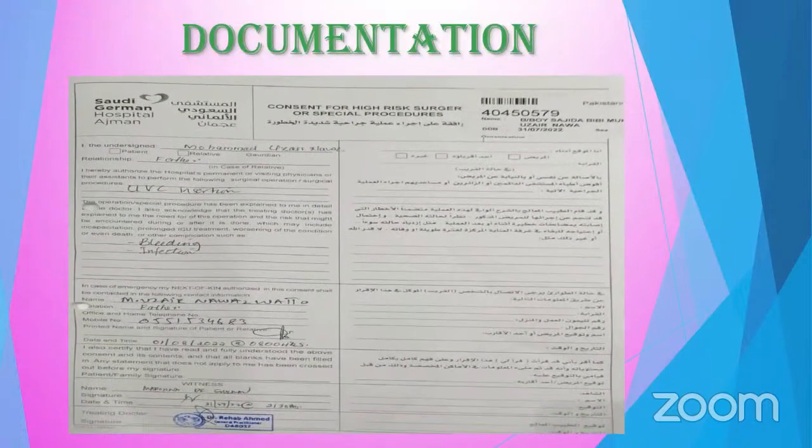So for documentation, first, we need the consent, a high risk consent. For a demo only, we use this current patient. We inserted this one last, and the consent was taken last August 1. There is the doctor, witness, and doctor's signature. UV insertion, infection, and bleeding risks, as you can see. Then the father signed there. This should be the parent or guardian.